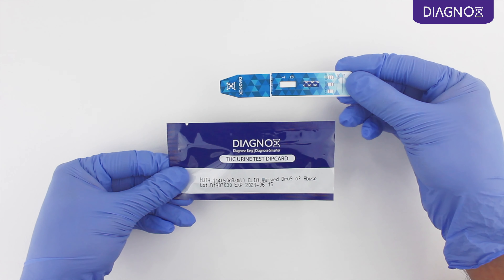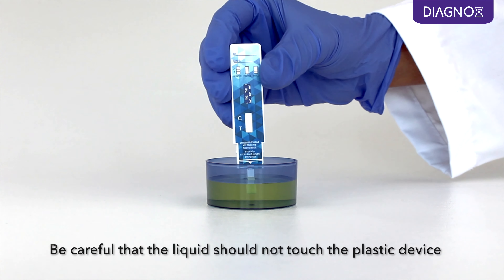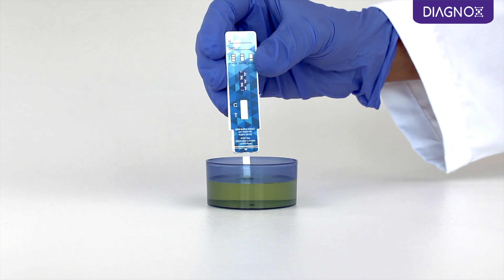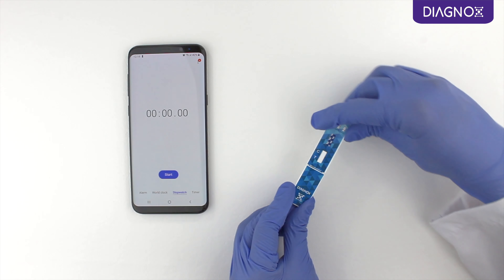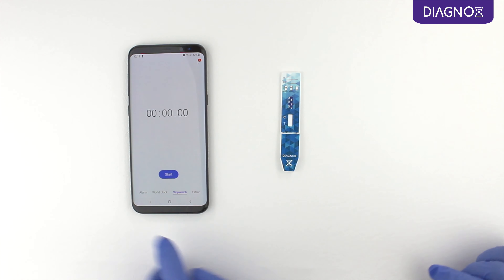Take the dip card out of the pouch. Remove the cap and immerse the dip card into the urine sample for 10 seconds. Close the cap and lay the dip card flat on a clean surface. Start timing.